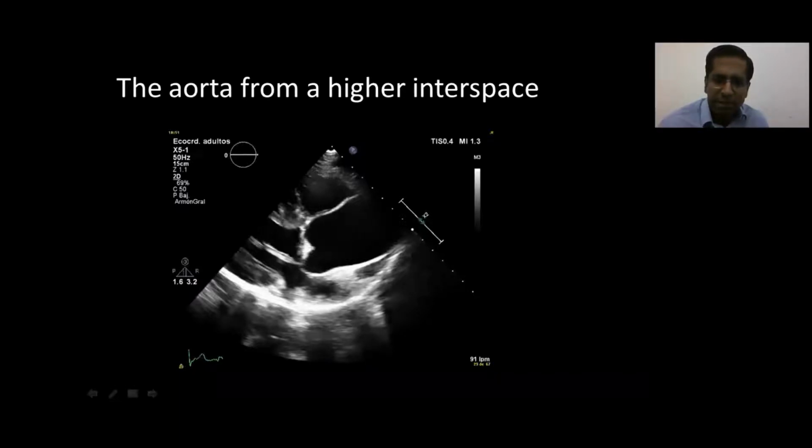I told you for the aortic annulus, you have a nice landmark. That is the hinge point of the mitral valve here, the hinge point of the aortic valve here, and you can measure it here. But for the ascending aorta, there is no such hinge point or landmark. So that becomes difficult, because we measure it here one time and somebody else may measure it here the next time. And there may be no chance, or follow-up becomes extremely difficult.